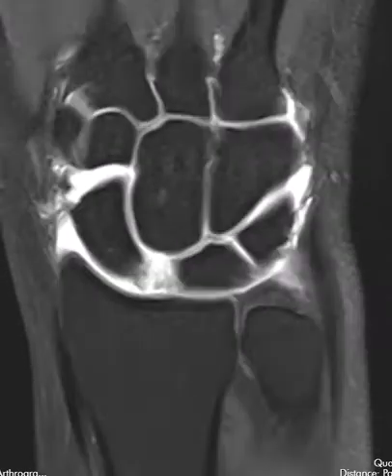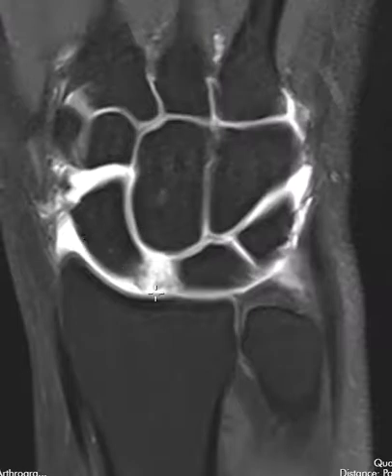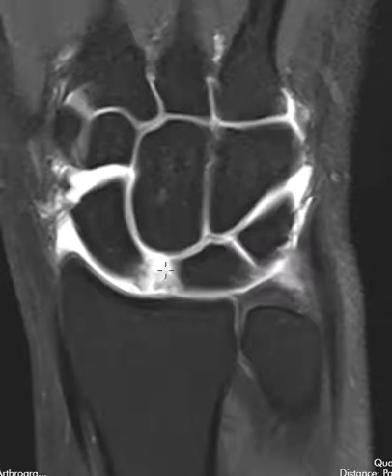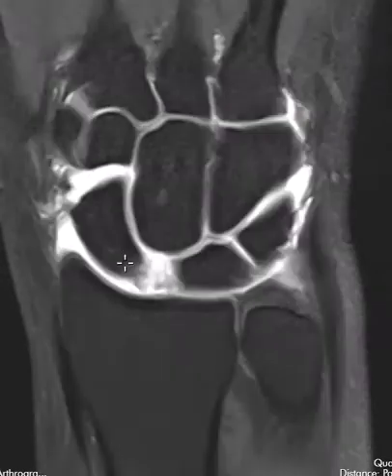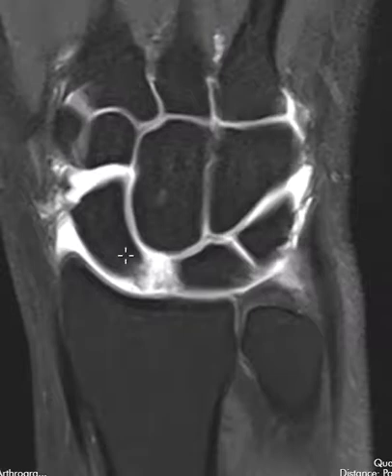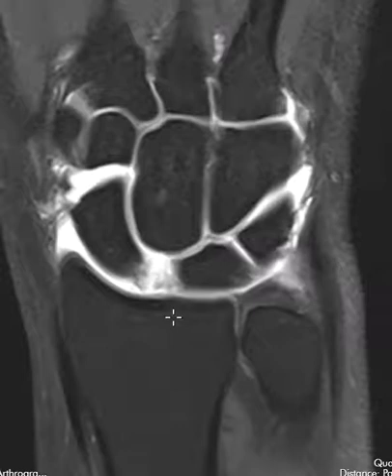The scaphoid bone will eventually start to collapse and have arthritic change. Right now we're catching it pretty early because there's no arthritis — just significant widening — and this is at high risk to go on to arthritis. When they get arthritis in the wrist, especially on the radial side involving the scaphoid bone, bony collapse, and the lunate as well, we call it a SLAC wrist — scapholunate advanced collapse.